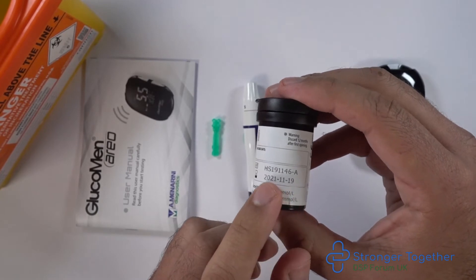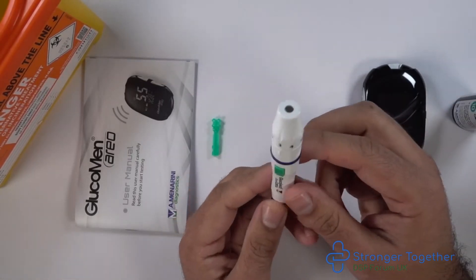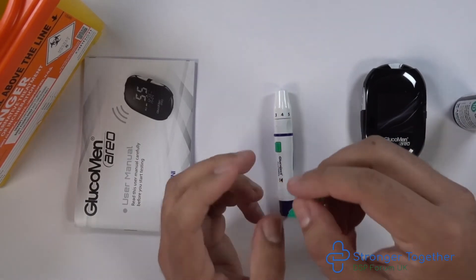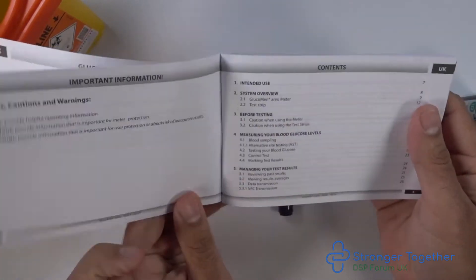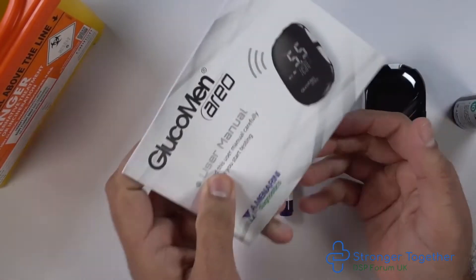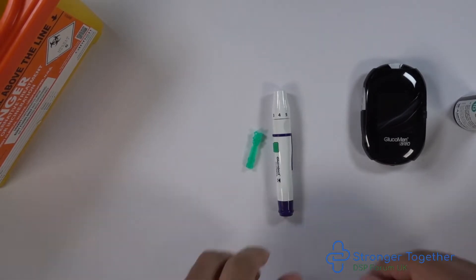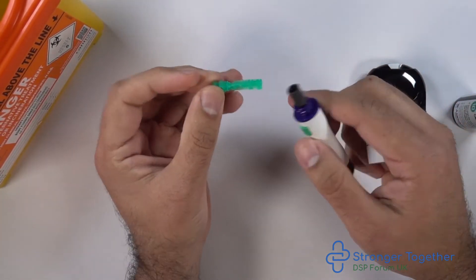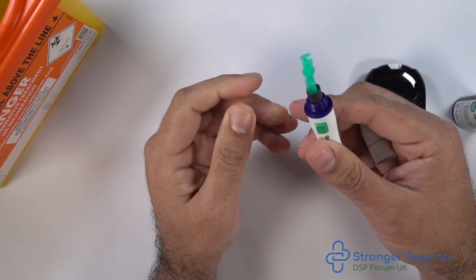Check the expiry date. Here we have our glucoject dual lancing device and the lancet. This is our instruction manual. If we look at the section for measuring your blood glucose levels, you can see there are some detailed instructions on how to measure your blood glucose in that manual, so please refer to that if you need any further help. We made a separate video about the glucoject dual plus lancing device detailing instructions on how to load it safely and discard the lancet, so please see that video.